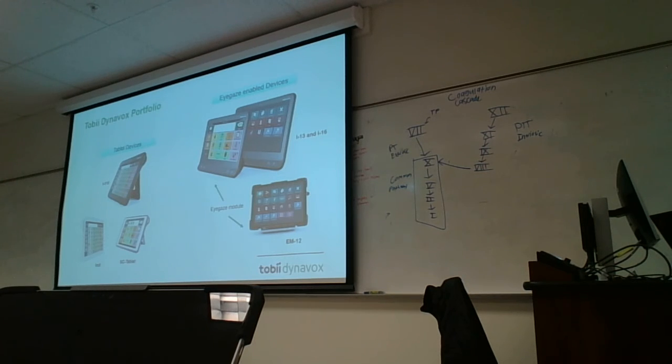So it's something that some of our users that are out in the community, out of the house a lot, generally do go for. And on the Windows-based devices, such as the Indie and the I-110, you can put Communicator 5 or Snap Core First, but the SC tablet, the Apple-based product, is only Snap Core First.